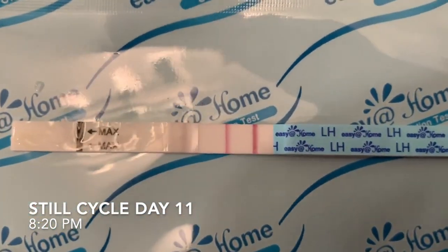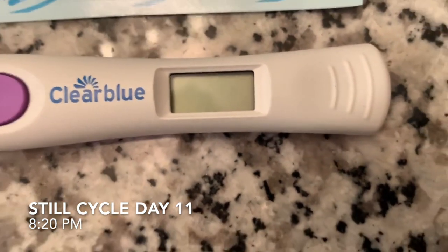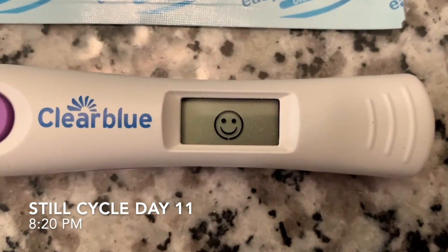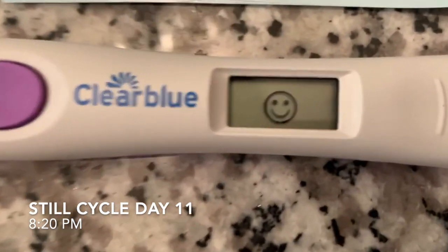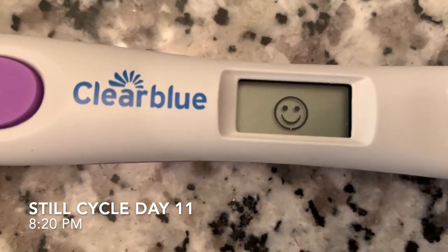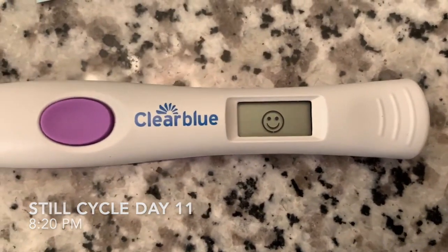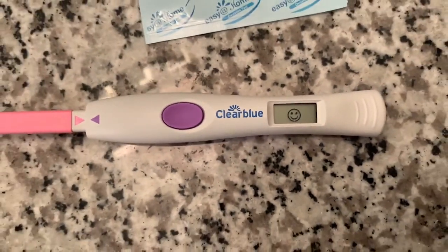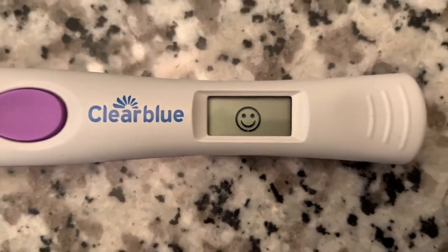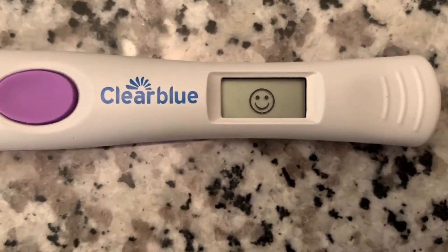Okay, so this is looking more like what I'm used to seeing. So the app gave it a 0.53, and I'm sure it'll still be an empty circle. Oh, never mind. Oh my gosh. What the heck? Wow. Never mind. Okay, this is why I like to do this, because you saw how light that was earlier today. Wow, that was fast. That was super fast, which means I'm inseminating tomorrow morning. Wow. Okay.